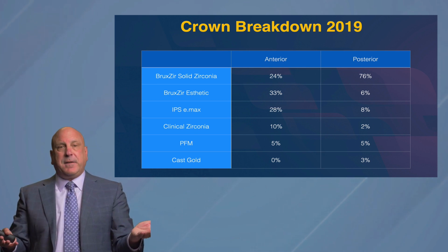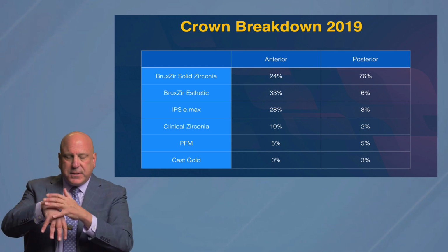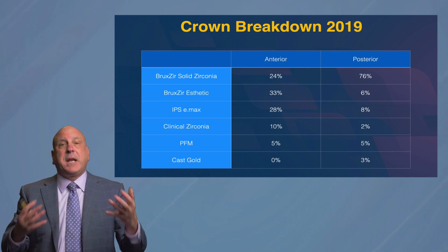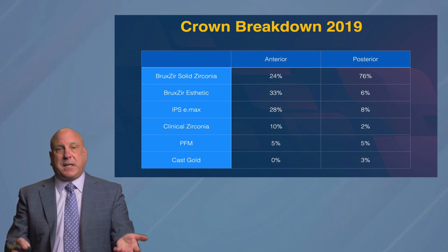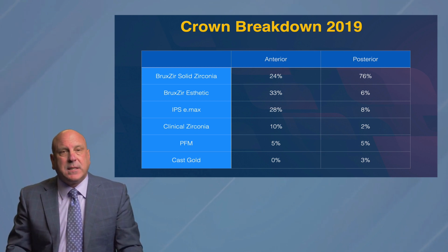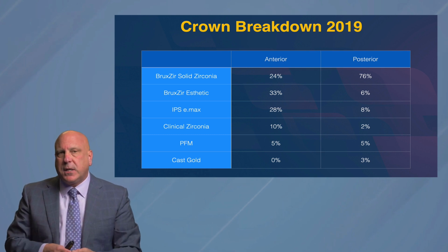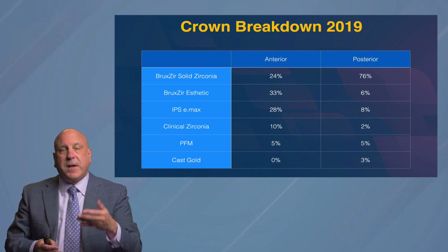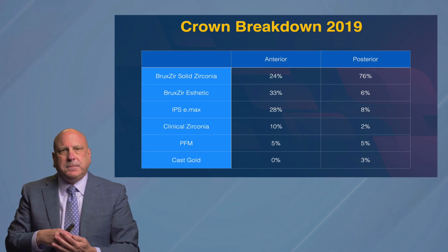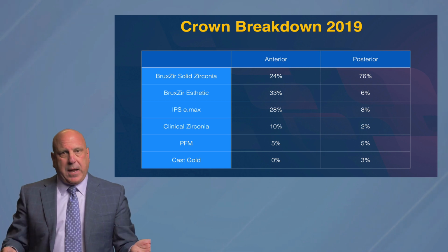And again, that's fine if you like the idea of having a zirconia substructure and having your technician layer the feldspathic porcelain. You can certainly get a more aesthetic restoration, and a great technician can give you an amazing result with a bilayered restoration like this. But again, you have to make sure you reduce enough for the technician to use both of those materials. And you also have to know that the feldspathic porcelain on that clinical zirconia crown is the weakest ceramic material that we have out of all our ceramic choices.